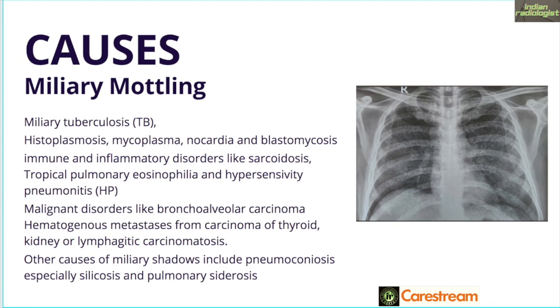Miliary mottling is basically a lesion that is up to 2 mm. Anything more than 2 mm up to 7 mm is usually classified as a pulmonary micronodule. Nodules are characterized by lesions in the dimensions between 7 mm and 30 mm. And beyond 30 mm, those lesions are called pulmonary masses. This is the differentiation based on sizes and this is the case of miliary mottling. We move to case 2.